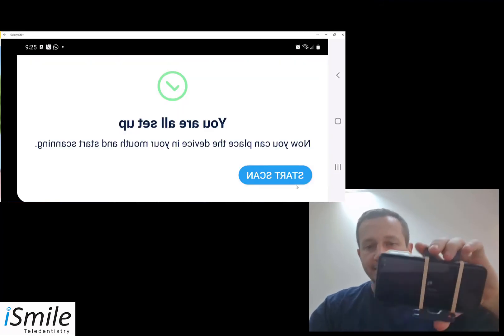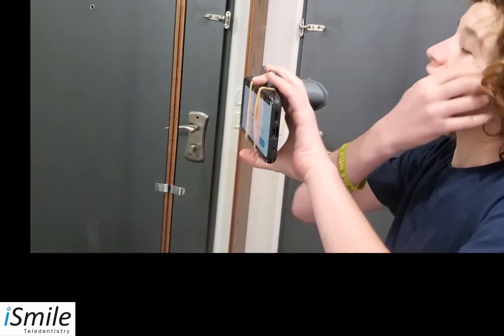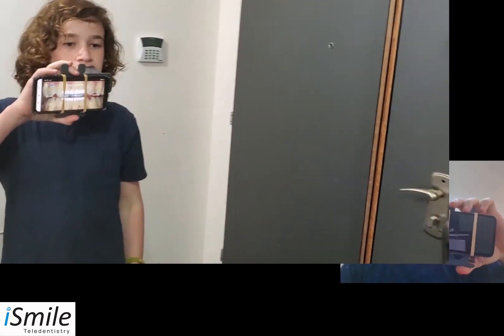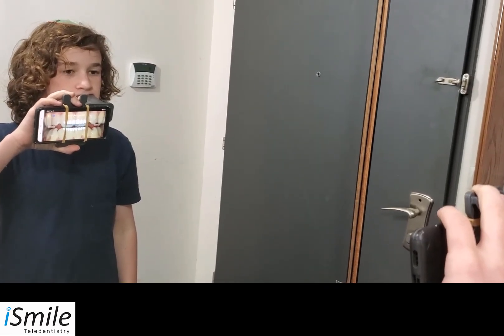You will now see that the text appears backwards, as this scan should be done in front of the mirror. Simply put the device in your mouth one side at a time and click the start scan button. You will perform the scans according to the prompts on screen. It's important to face the mirror and keep your head straight the entire time while moving the remote monitoring scope with your cell phone attached.